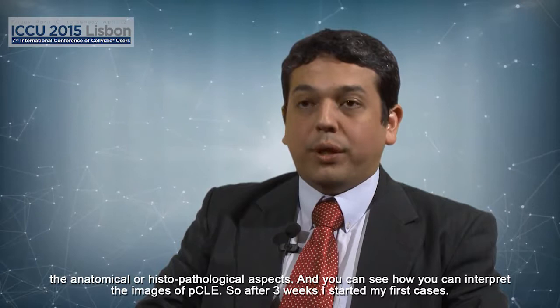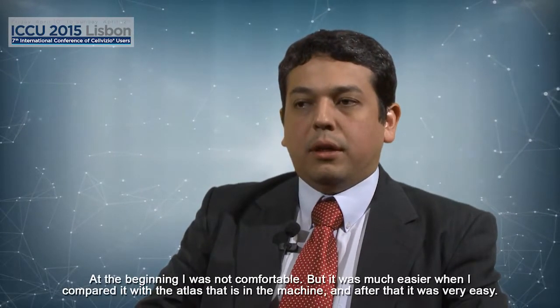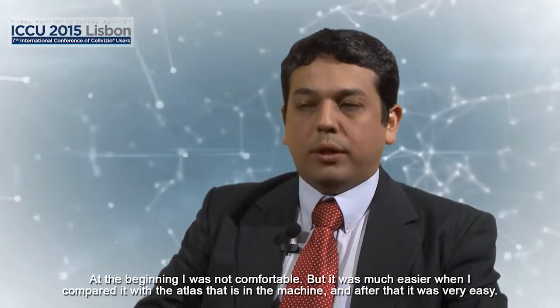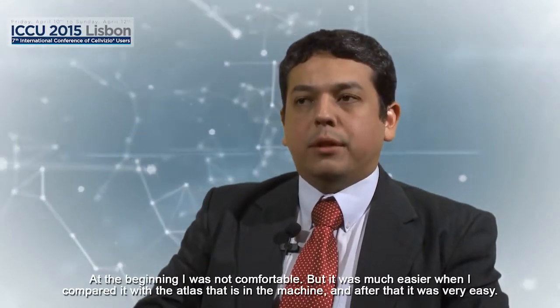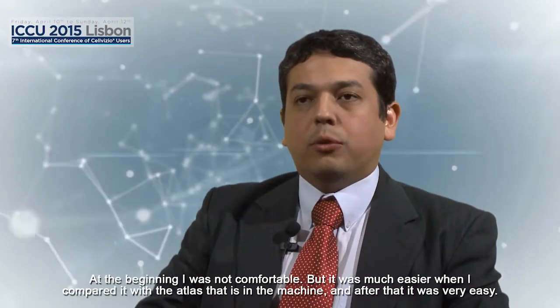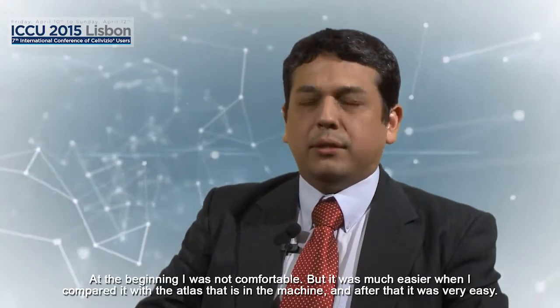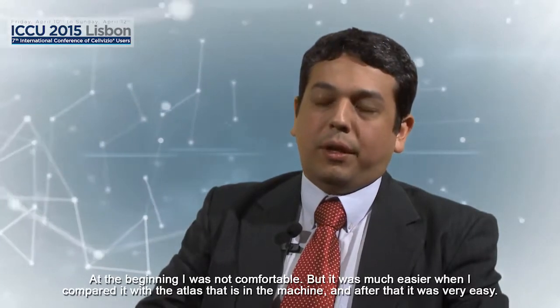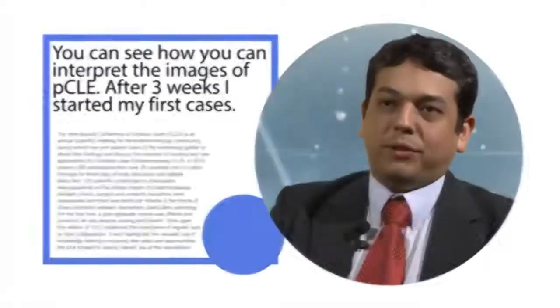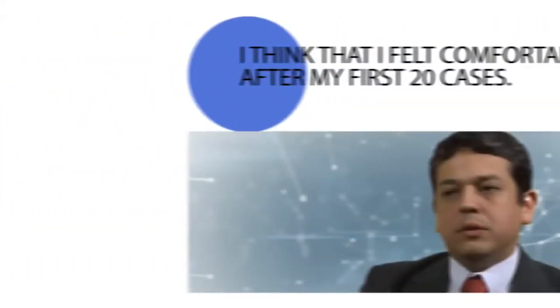So after 3 weeks, I started my first cases, and at the beginning I was not comfortable, but it was much easier when I compared with the atlas that is in the machine, and after that it was very easy. I think that I feel comfortable after 20 cases.